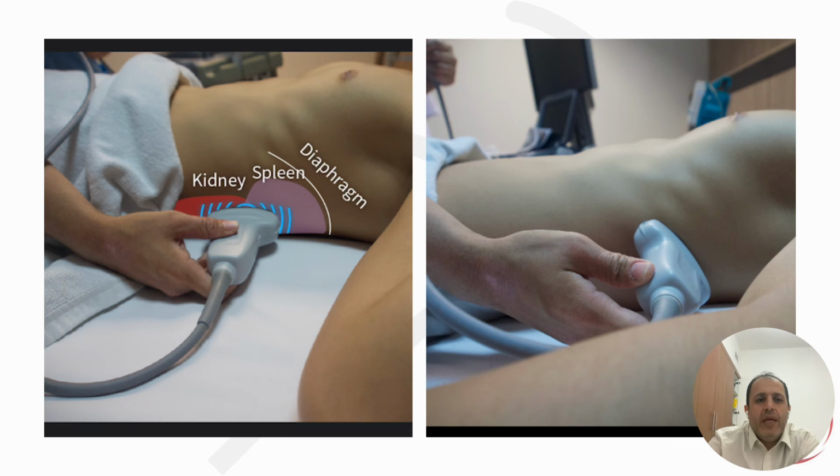So another view, it is left upper. Another place we should check in EFAST. So in the left side also we have diaphragm, spleen, and the kidney. We keep the ultrasound probe transducer vertical. Comparing to the right side, the left kidney is more posterior and more superior.